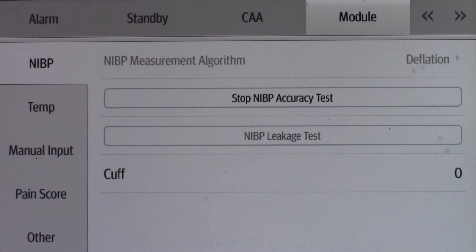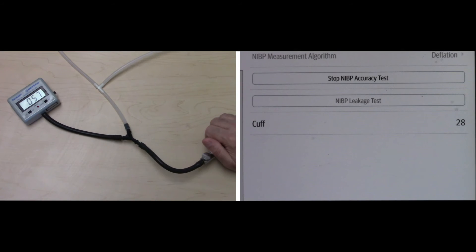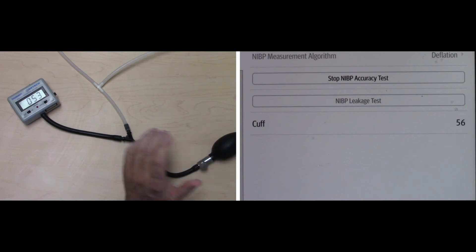Check that the readings on both the manometer and the monitor are zero. Raise the pressure in the rigid vessel to 50 using the balloon pump, then wait 10 seconds so that the measured values become stable. Check that the difference between the reading of the manometer and that of the monitor is within 3. If it is greater than 3, contact your service personnel.